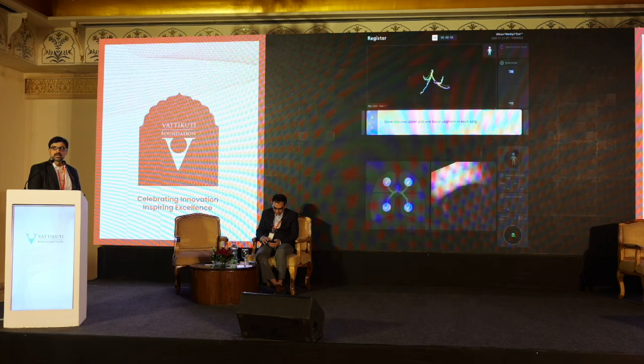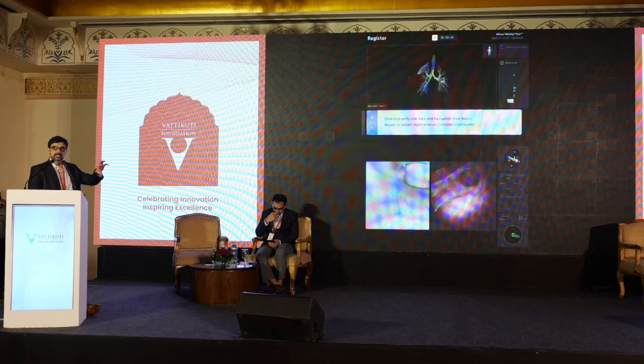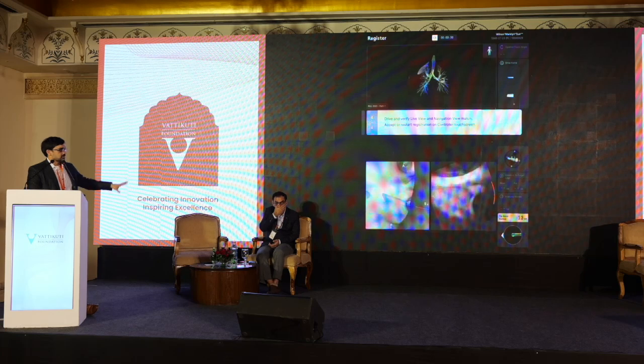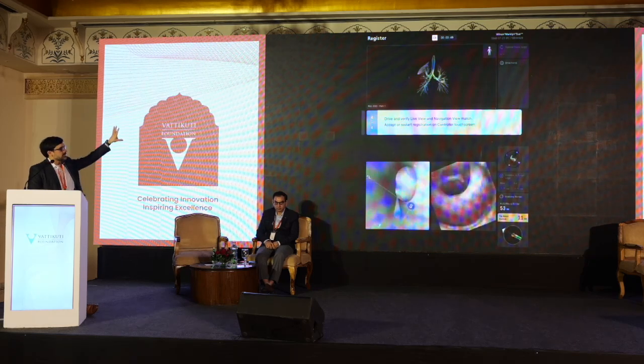And so this is the ION bronchoscopy. Prior to the procedure, myself or our pulmonologist who does most of these will upload the CT scan into the software, and the software will provide almost a GPS in order to identify and get to the nodule. The bottom left is the GPS, the right side is the live view, and the top is the map.